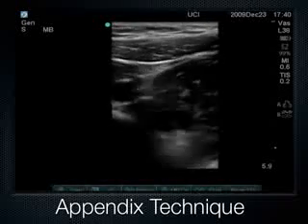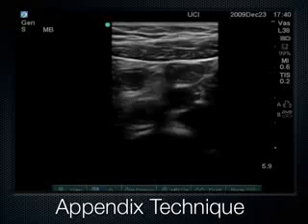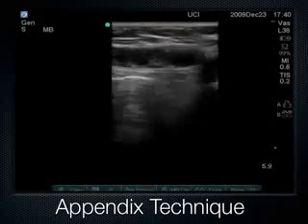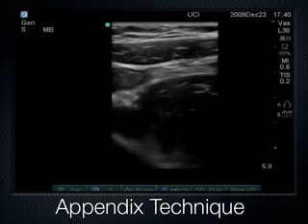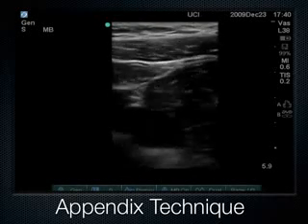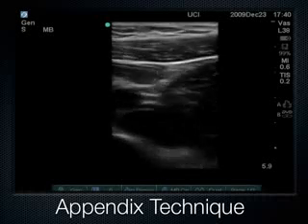So this is kind of what we do. Here's the abdominal wall musculature up here. Here's the loop of bowel right there, okay? This is the iliac vessel right there. And what we're doing is we're pushing really hard. So this muscle right here, this is the psoas muscle. The psoas muscle is actually coming up and coming into contact with the abdominal wall musculature right there.